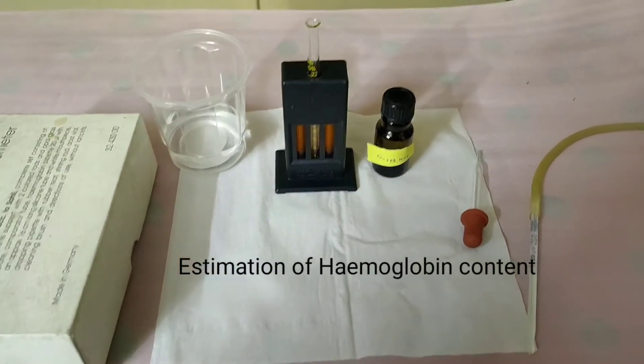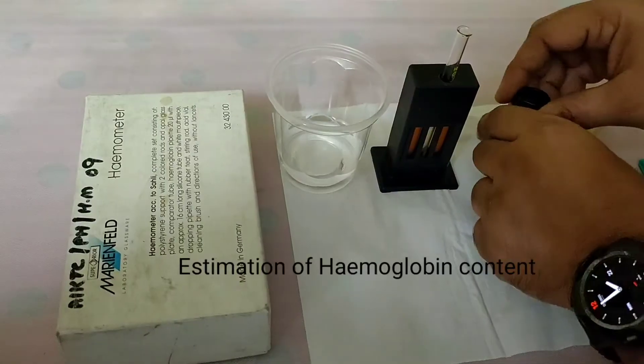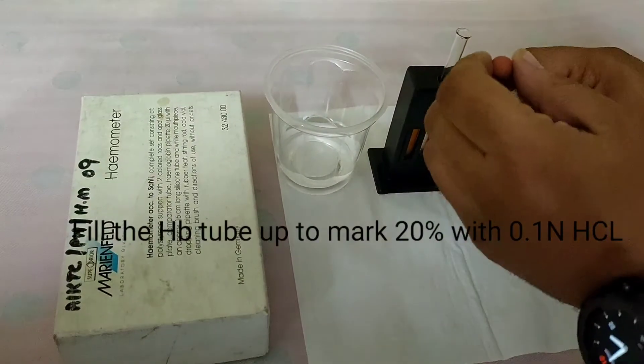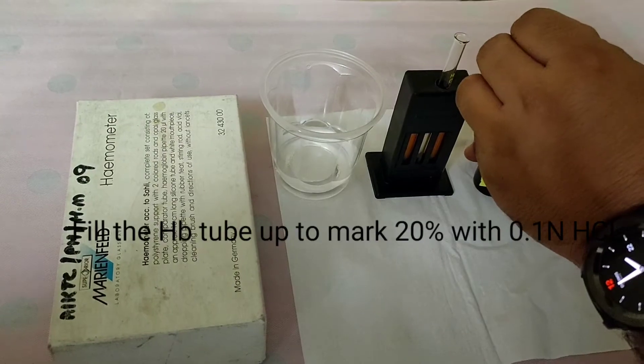Everyone, let's perform the practical estimation of hemoglobin content. First, fill the HB tube up to the mark 20% with 0.1 normal HCL.